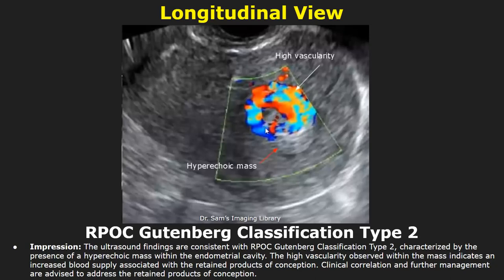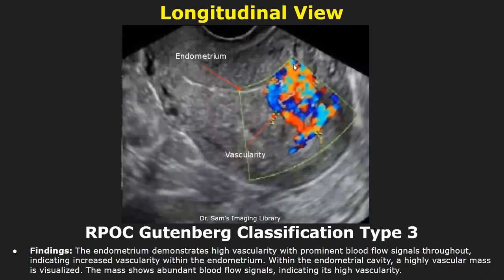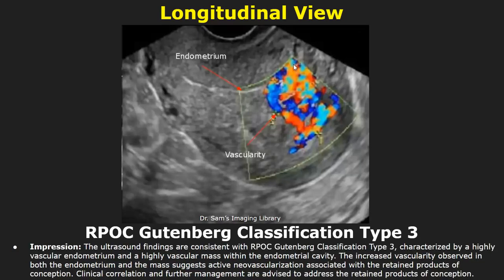In the findings of a type 3 RPOC, there is increased vascularity noted within the endometrium as well as increased vascularity within the hyperechoic mass. You can write these findings in the impression and then write about clinical correlation.